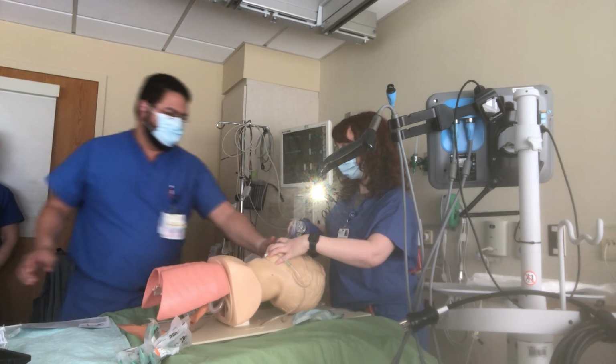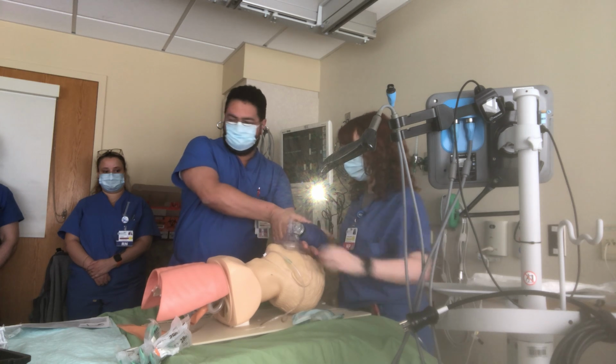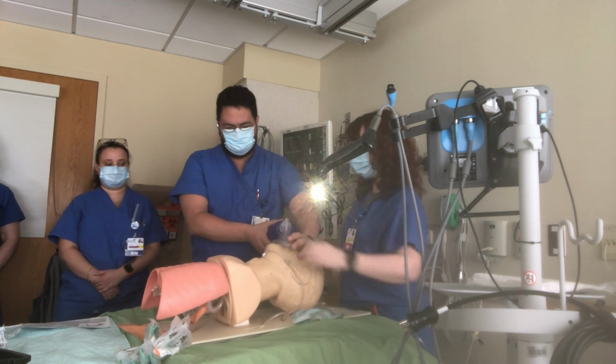All right, let's do it from here. Okay, so I'm ventilating him now, right? One second, let me ventilate. And Amanda, you come next to me.